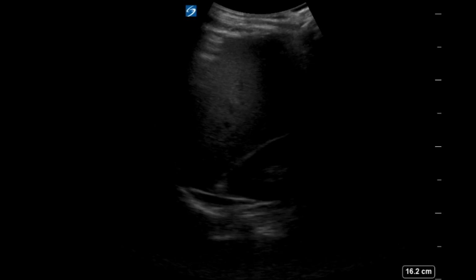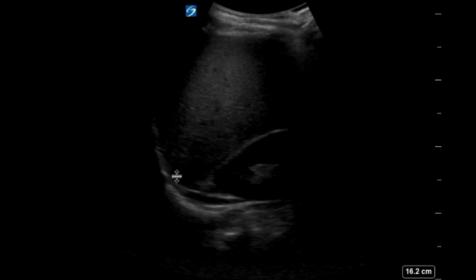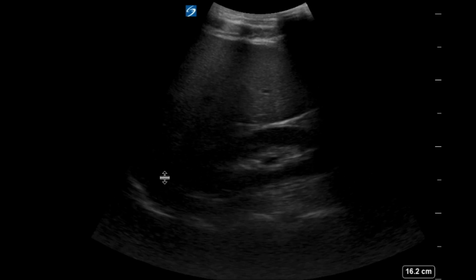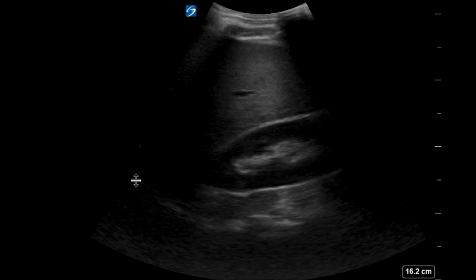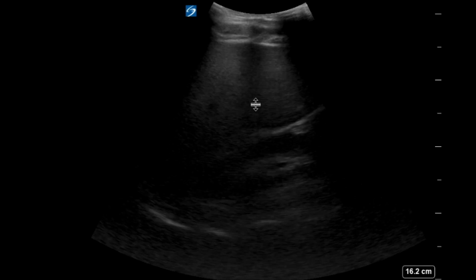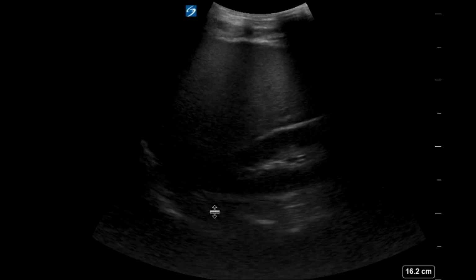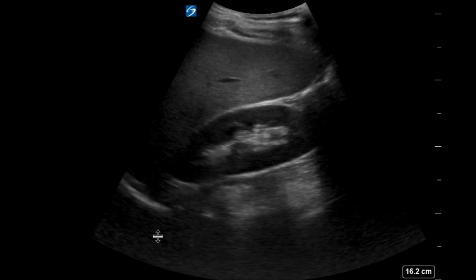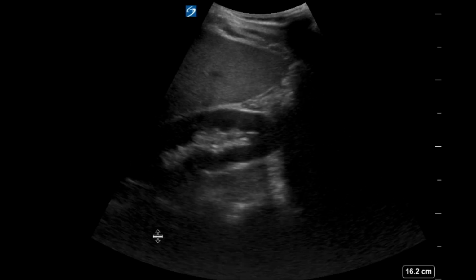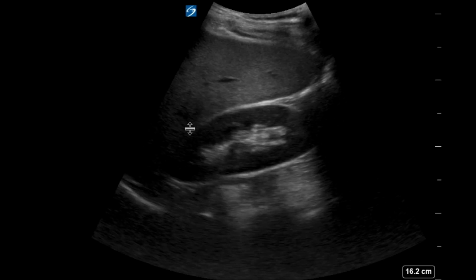We see the liver and kidney, a little bit of the diaphragm curving around here. But looks okay so far. Do a little bit more of the right upper quadrant. Have a little rib shadowing here as well, getting in the way, but overall don't see anything abnormal. And then they're including the liver tip down here as well, just to make sure that there's no free fluid there.